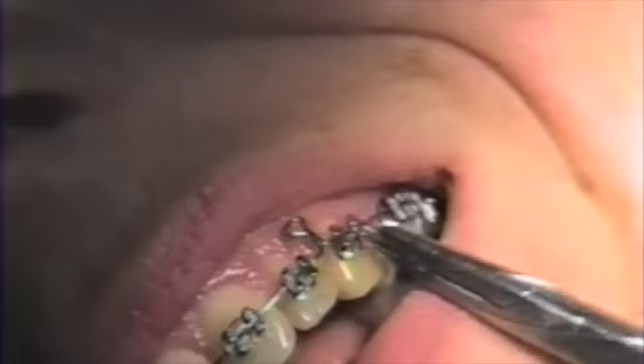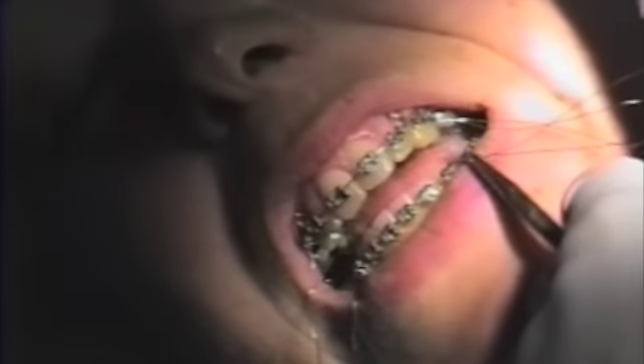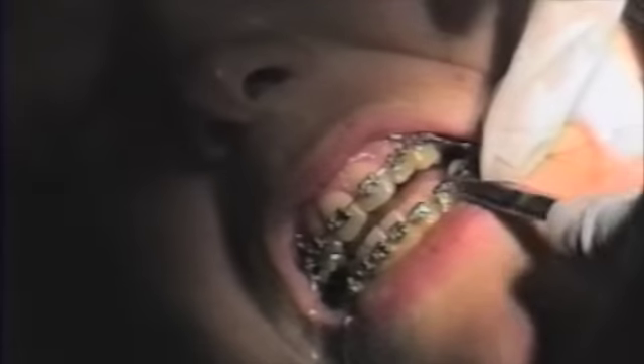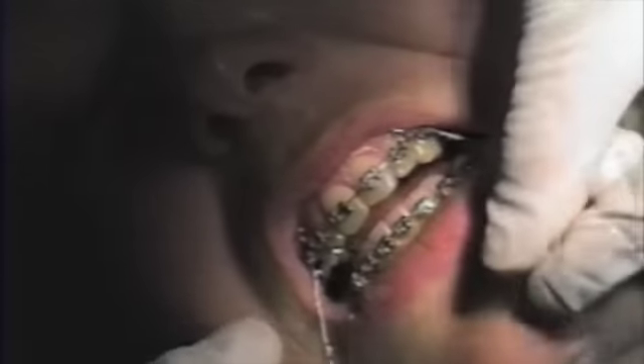Gray elastic ligatures are not sufficient to prevent this rotation. The pigtails should be placed on the distal of the distal tie wing of all cuspids.